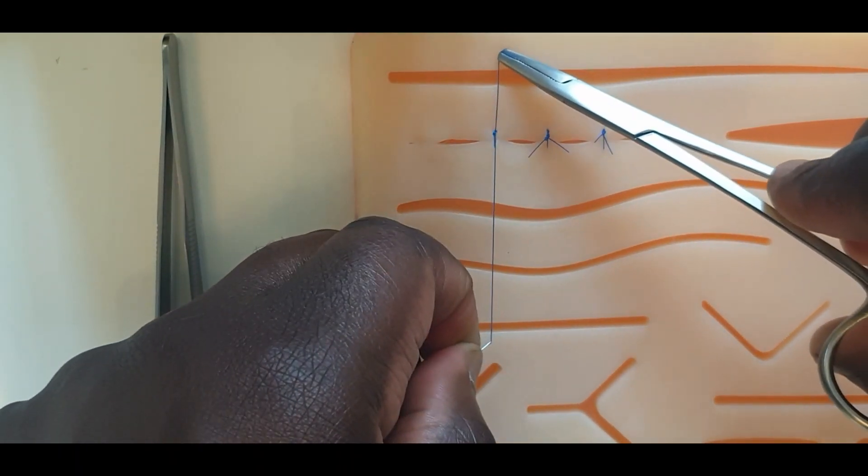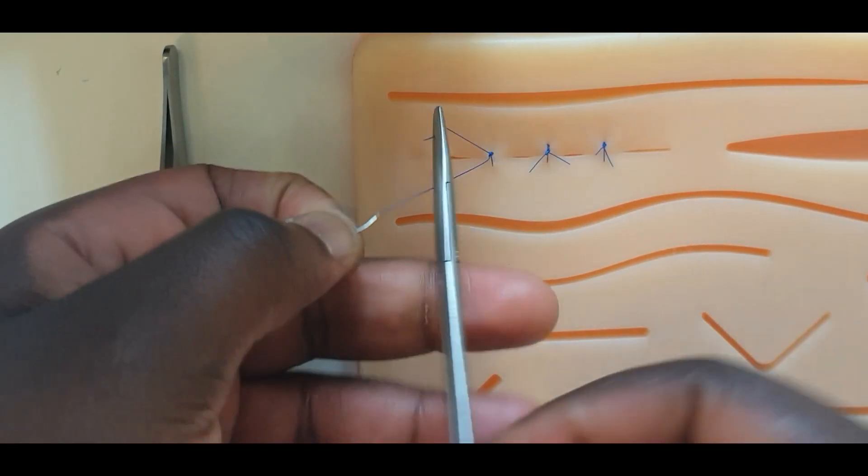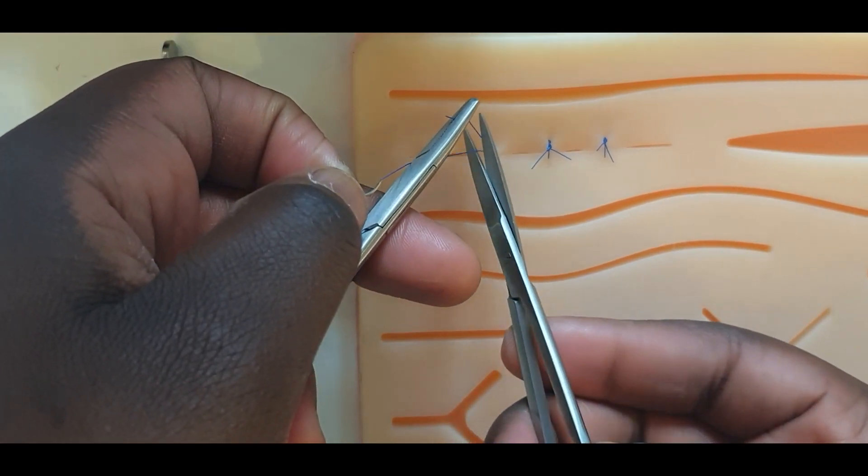It is during the third knot that the suture threads are laid to alternating positions.